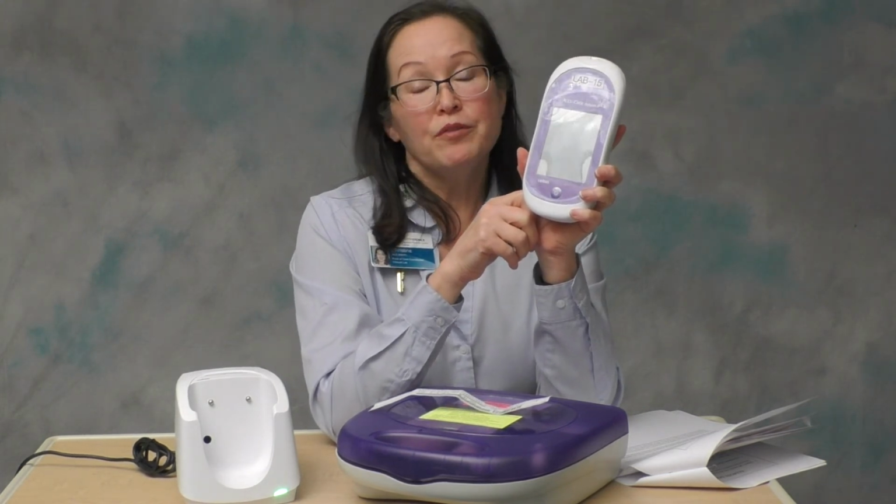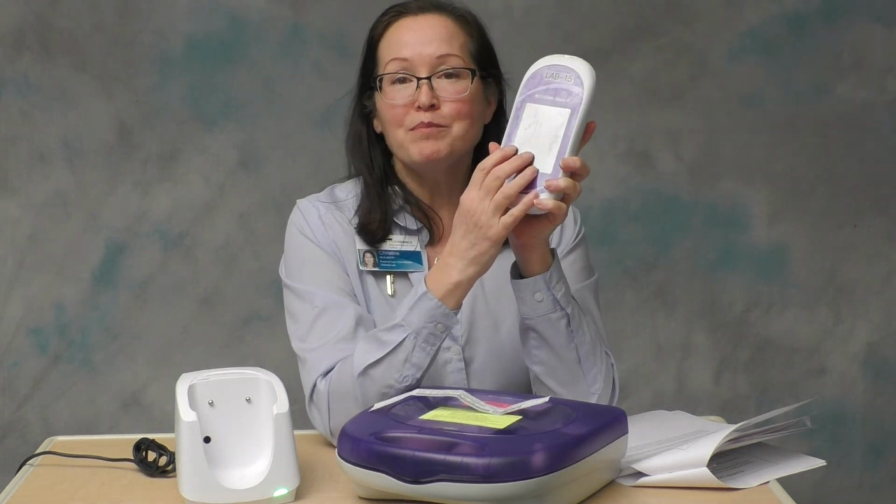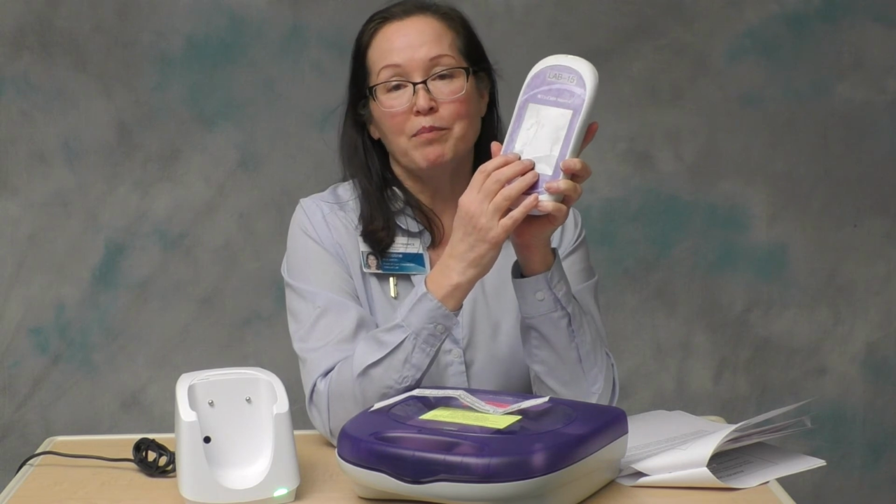I can tell you about once a month, we get a call from the Family Maternity Center asking us how we can get a glucose result out of the mom's chart because the test was actually run on the baby. So there's no excuse for it. When you scan mom's ID band, mom's name and date of birth will pop up on the screen. That's not the patient you're running the test on. Hit the red X and go back out, get the correct ID.